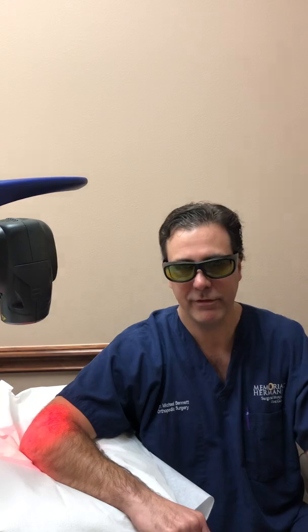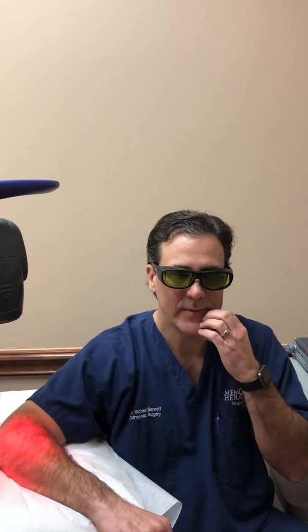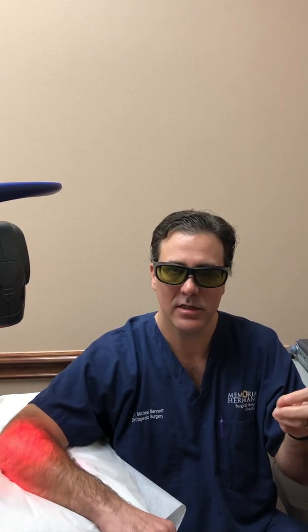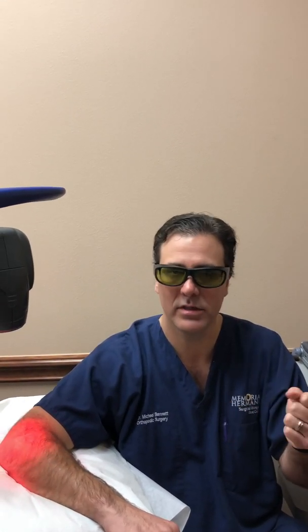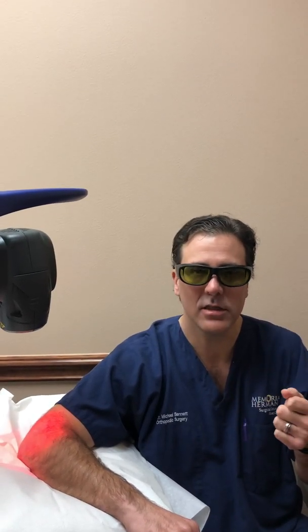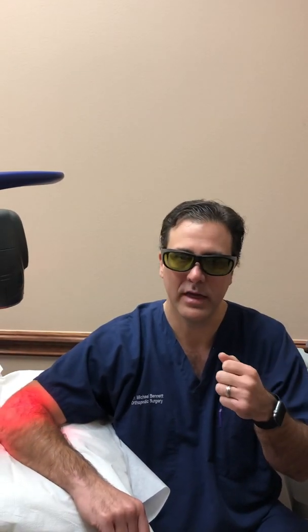It's a cumulative effect, so you don't just get one treatment — it's additive. We usually recommend doing this every other day for at least 10 to 12 treatments, depending on the situation. This is a great adjunct that we're providing in our clinic for patients that aren't getting any relief from steroid shots, visco-supplementation, or even surgical intervention for post-operative pain.